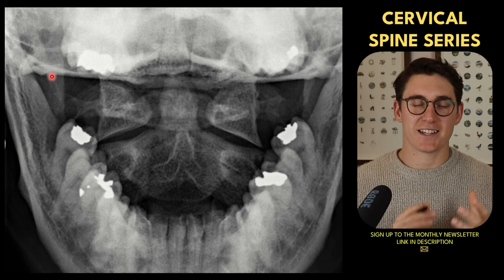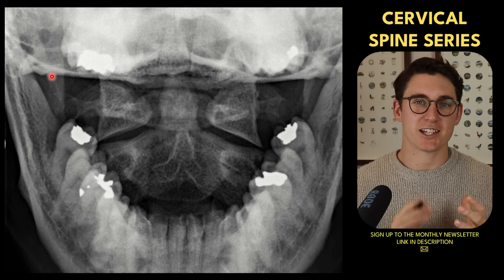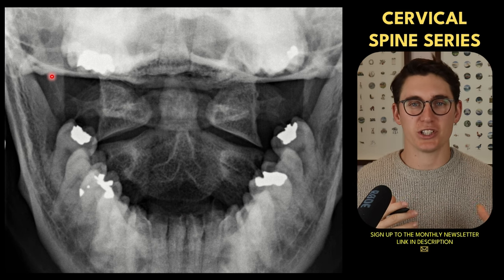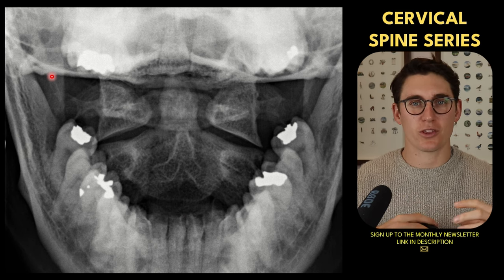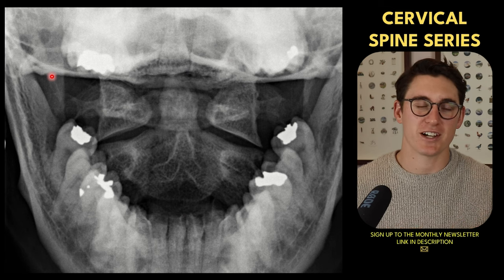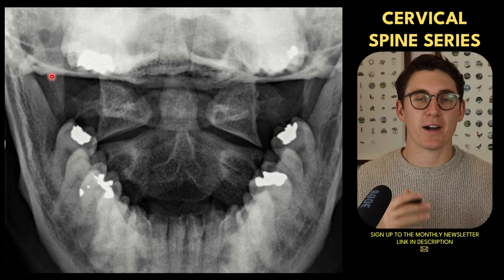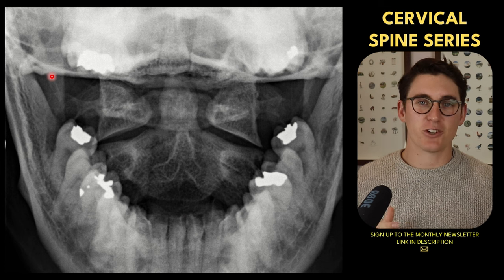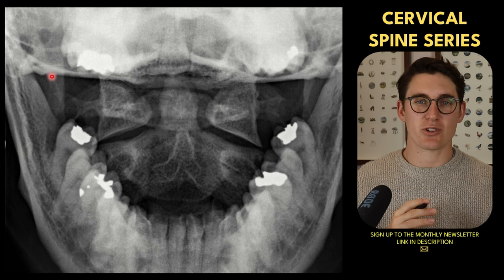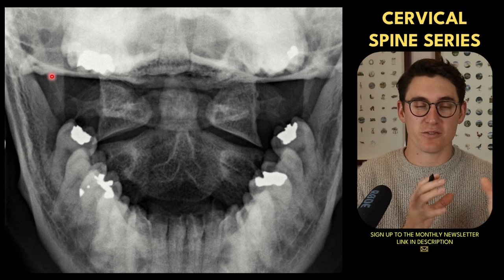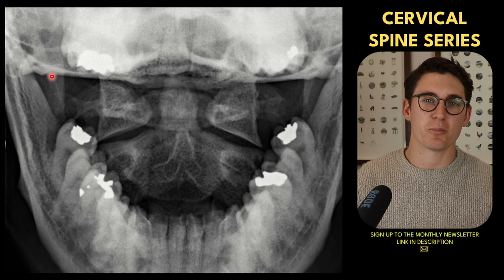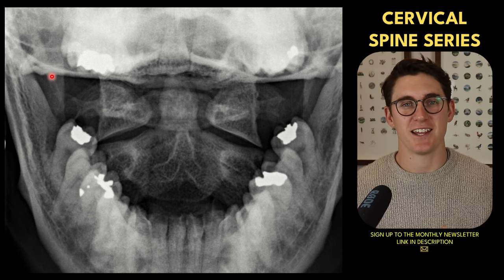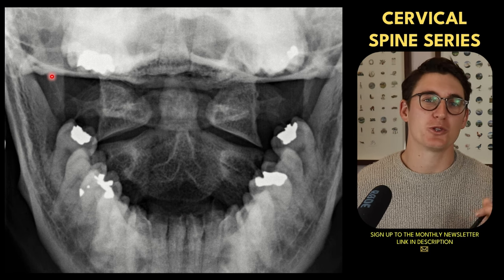Before we get on to looking at the anatomy on an x-ray, I first want to look at a CT scan so we can gain a greater appreciation for the 3D morphology of the cervical vertebrae. They are quite different to the thoracic and lumbar vertebrae, and it's difficult when we look at an x-ray and try to appreciate which bits of the vertebrae are where, because everything is superimposed on top of one another. So let's head over to a CT scan and then go to our x-rays.